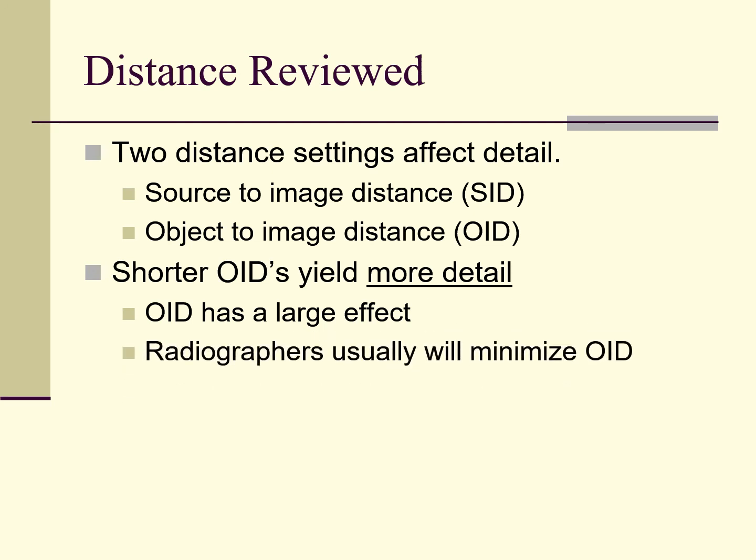If you're asked why a position is done, either AP or PA, the answer is usually to increase detail or to minimize magnification by placing the object being studied as close to the image receptor as possible.